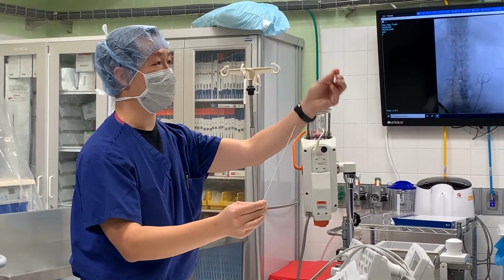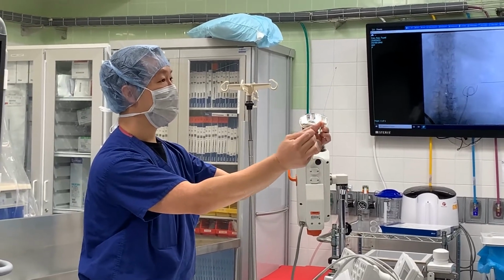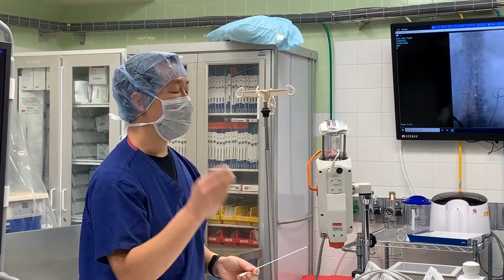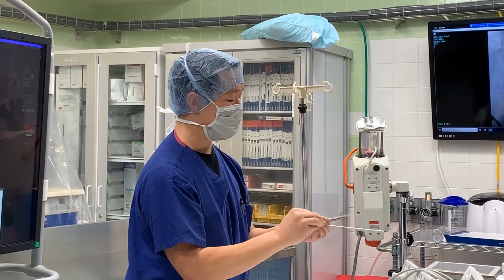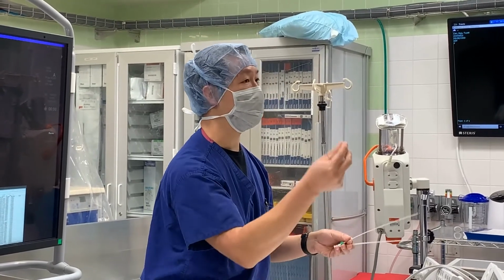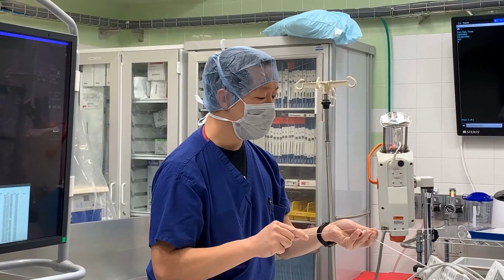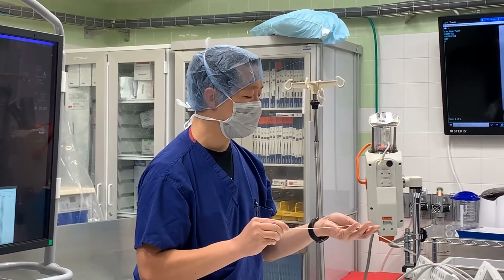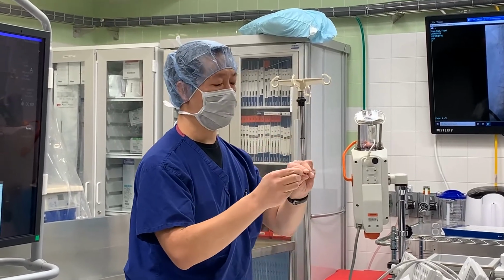Does anybody know the size of this? If this is 6, and this is a standard wall thickness catheter, what size is this? 4. Good, right? Same thing as the sheath sizes. If we're not sure we're in, we take this out and put this in. Why? Because once you put this in and take this out, you can inject through it. You can now see if there's urine return that you might not have gotten with this, simply because of the caliber difference.